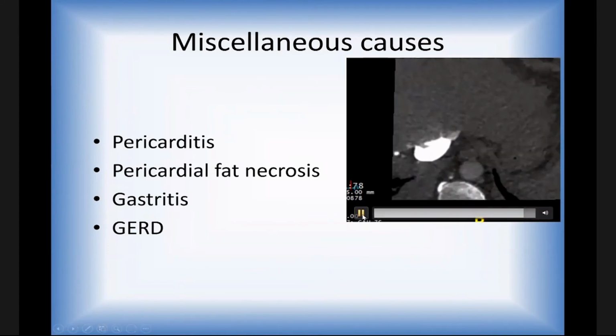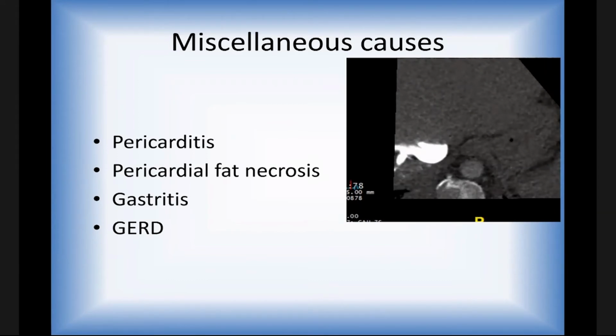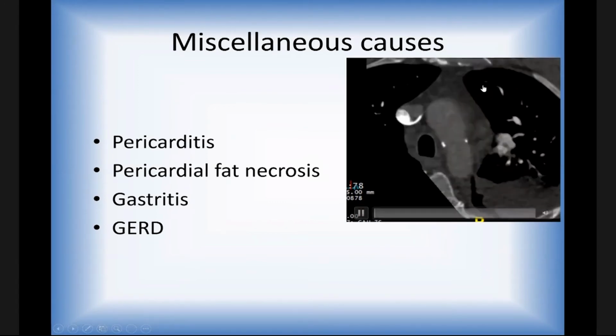when the patient got in here, we had nothing. The patient's heart rate was 70-something, and it was too high to do coronary CTA. So I gave him metoprolol until the heart rate came down. And then we did the coronary CTA. The patient got out of the scanner and fainted because his heart rate was so low. Because he has this pericarditis and pericardial fluid here, he needs to compensate.